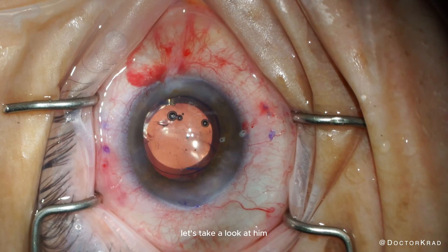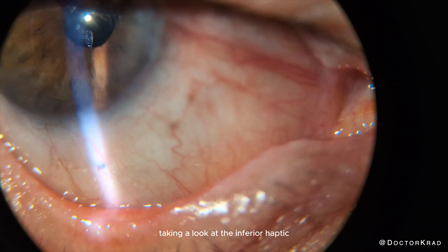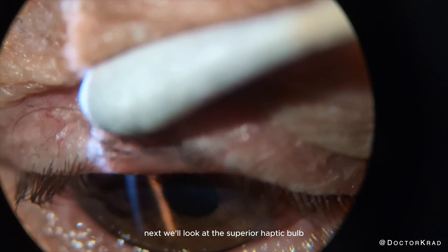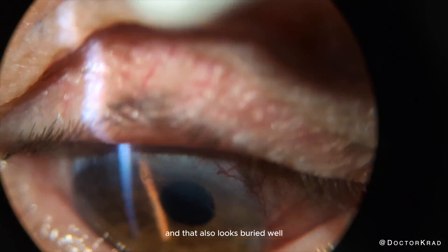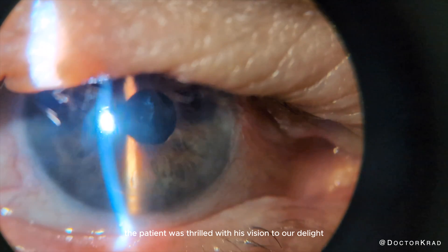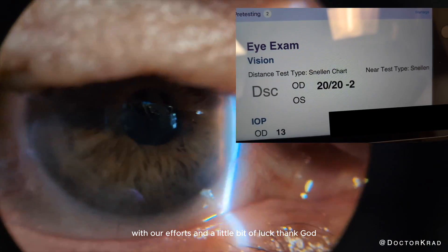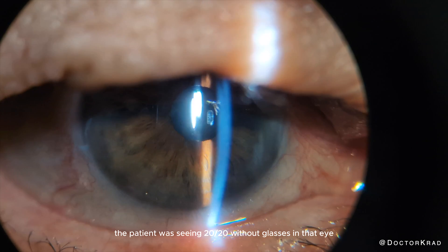Fortunately, the lens implant looks beautifully centered. Let's take a look at him a week post-op. The inferior haptic looks well buried, and he's healing beautifully. The superior haptic bulb also looks buried well. The lens looks very well centered. The patient was thrilled with his vision — to our delight, with our efforts and a little bit of luck, the patient was seeing 20/20 without glasses in that eye.